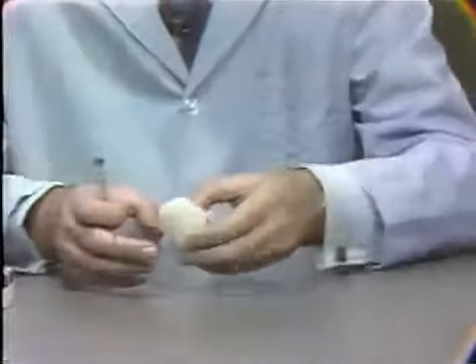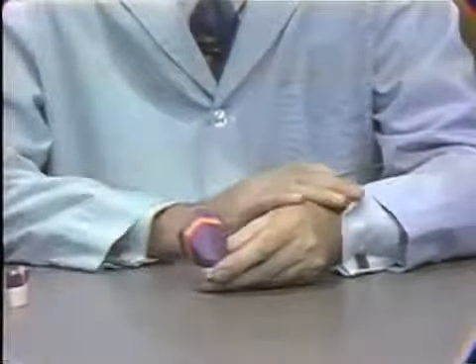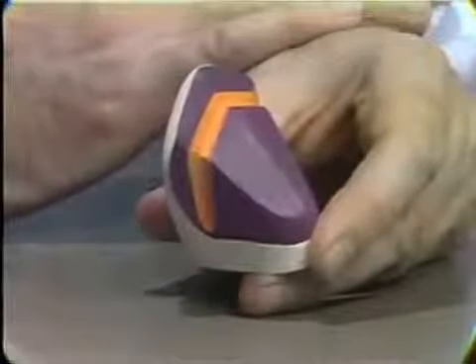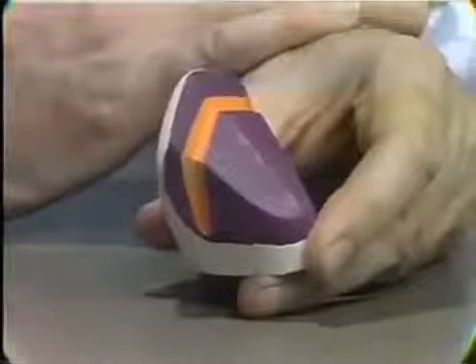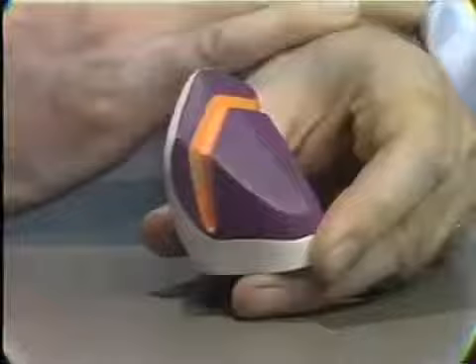Let's take a look now at the situation of the three-quarter crown on anterior teeth. And we have said that it's not so extensively used on anterior teeth as was the case in the past. It's been replaced to a large extent by the pin ledge restoration, which is easy to do technically and usually has the advantage of leading to better aesthetics. The three-quarter crown on the anterior tooth has the same retention characteristics as on the posterior teeth.